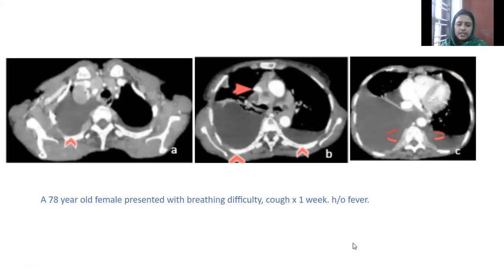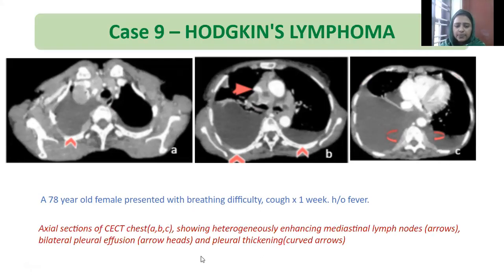Next case: a 78-year-old female who presented with breathing difficulty, cough, and fever for one week. CT images showing heterogeneously enhancing mediastinal lymph nodes, bilateral pleural effusion, and pleural thickening on both sides. Biopsy came as Hodgkin's lymphoma.